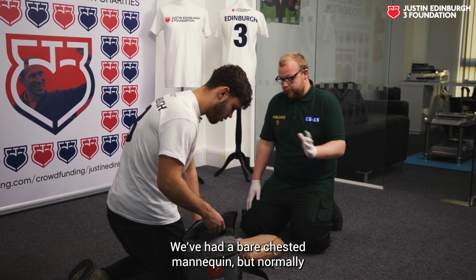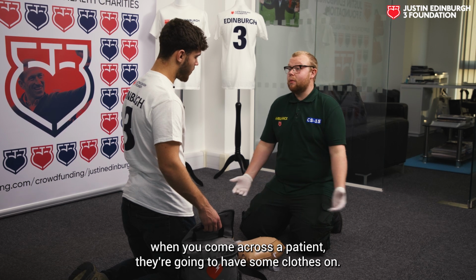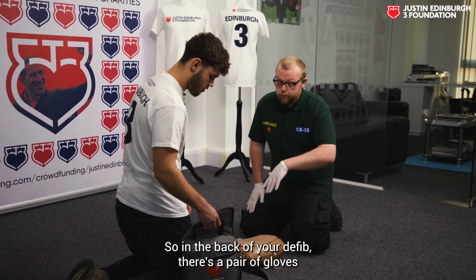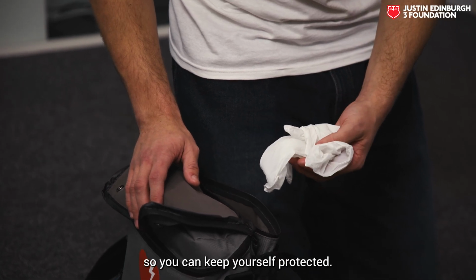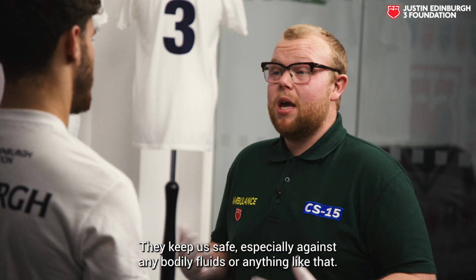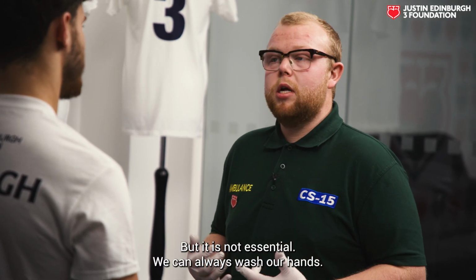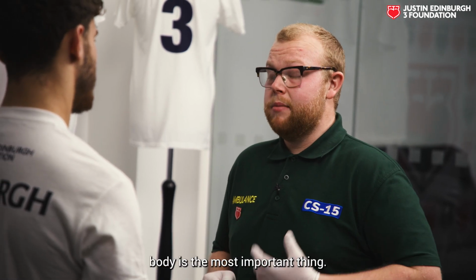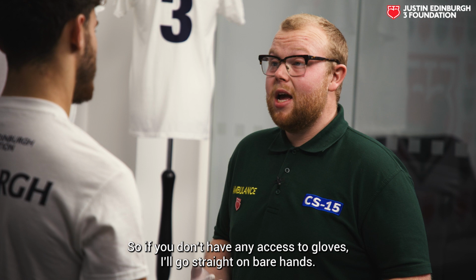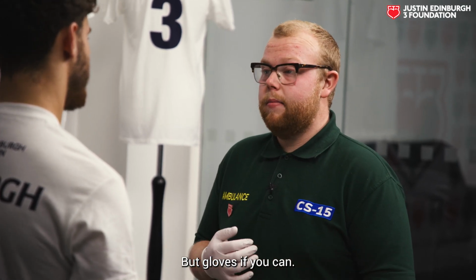Obviously, throughout our training, we've had a bare-chested mannequin, but normally when you come across a patient, they're going to have some clothes on. So in the back of your defib, there's a pair of gloves, so you can keep yourself protected. Gloves are really, really nice to have. They keep us safe, especially against any bodily fluids or anything like that, but it is not essential. We can always wash our hands. Keeping that blood pumping around the patient's body is the most important thing. So if you don't have any access to gloves, I'd go straight on bare hands, but gloves if you can.